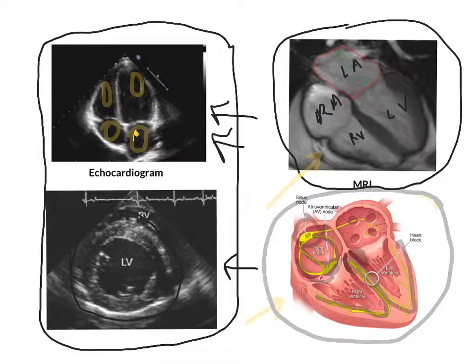That's kind of a simplified, if an electrophysiologist heard me say that, he'd probably have a heart attack. But sometimes you've got to explain things so that everybody understands, not just the medical people. So I wanted to go over this just to give you an idea of some of the imaging techniques that we have to look at the heart and how it can be seen in quite a few ways. There also is one other thing I want to talk to you about.